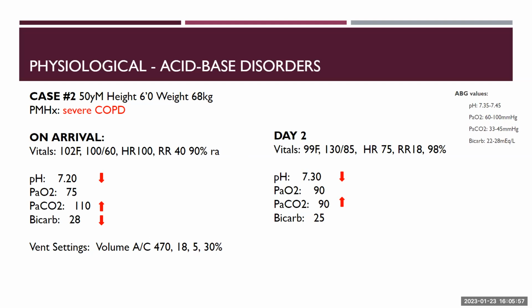The pH is becoming more physiologic. The PCO2 is still very high. What do you think about that? They could just be retaining this CO2 because they have severe COPD, obstructive. Right, you mean chronically retaining? Yeah. So their set point might be higher than normal individuals. Like their baseline. Right.